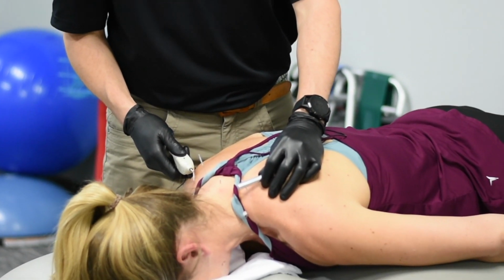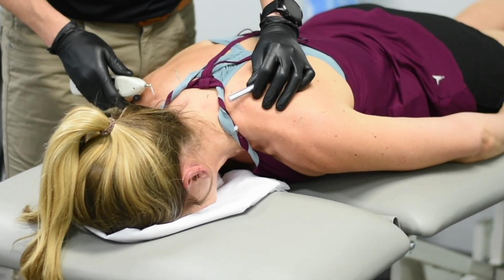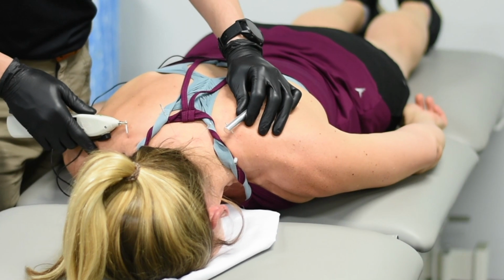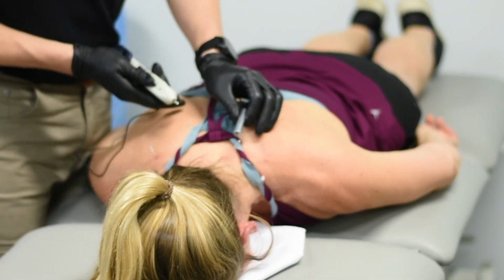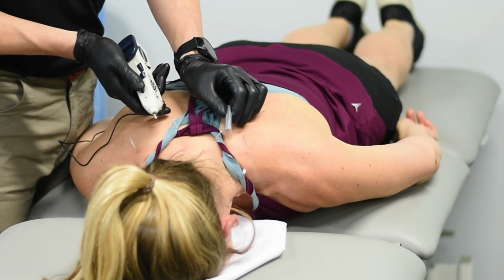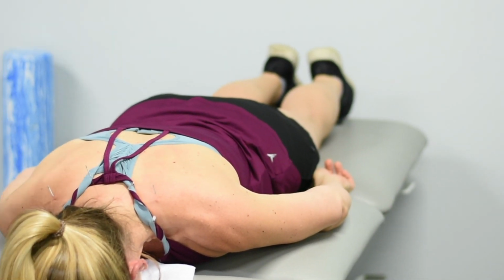Any thumping or anything there? Okay, go up a little more. Oh, yes. So now we've got the muscles jumping a little bit more. You okay there? Yeah. We do the same thing through here, where you just stim it and get those muscles to move. These are a little bit smaller muscles that are along the spine. These are bigger muscles, our posture muscles, and so this is one way to do it.